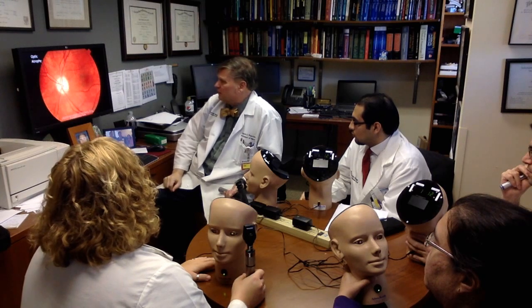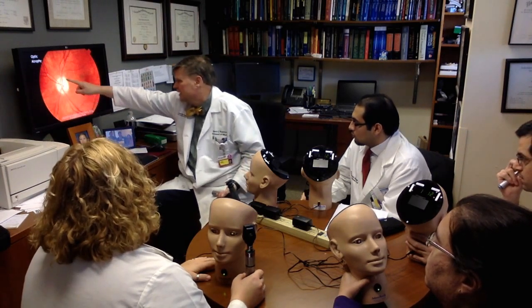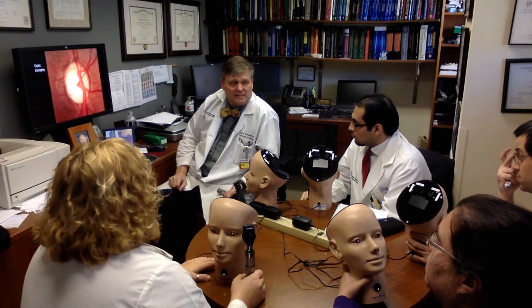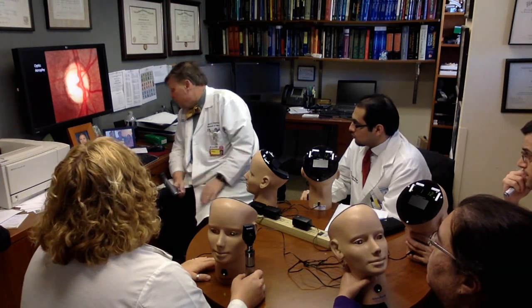This one's even better. It's this pale moon, okay? It's like the nerve cell layer. You can no longer make it out. Here's another one that's blown up. It's a pale moon, right? It's an end stage from many different things, and we'll see more of those in a second.